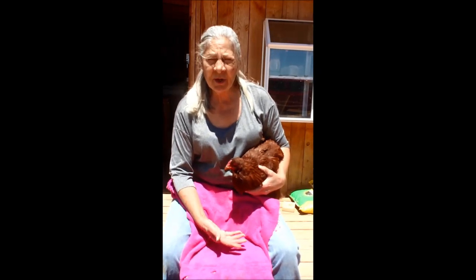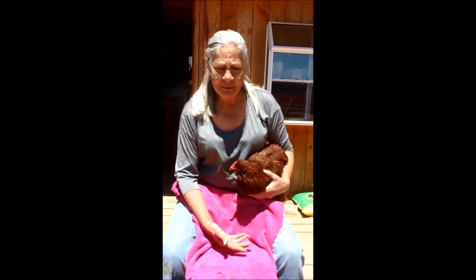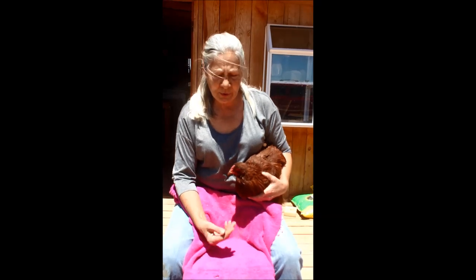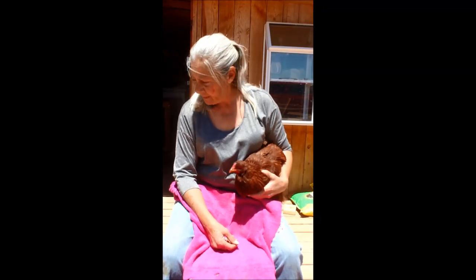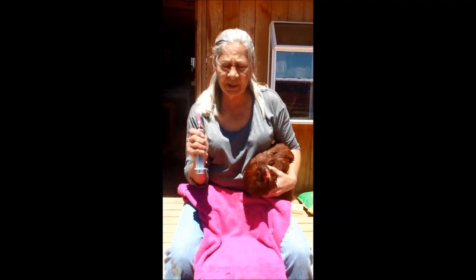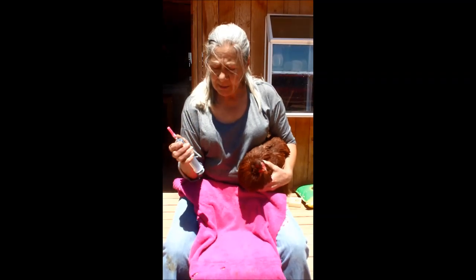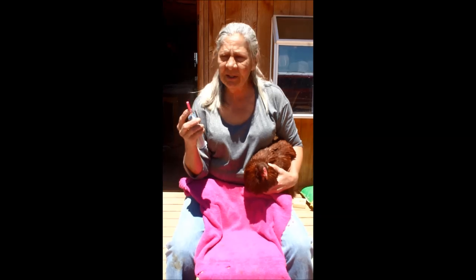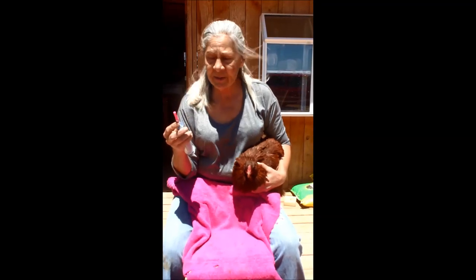The ascites can be drained off, and one of the things you want to do when you drain it is use a large enough needle to actually get in there in case you run into something that has to be filtered out. So I'm using a number 18. If you ever see anybody telling you to do this with a small syringe, don't do it. Those people are inserting the needle into this poor chicken 7, 8, 9 times to draw a little bit at a time, and that's just ridiculous.